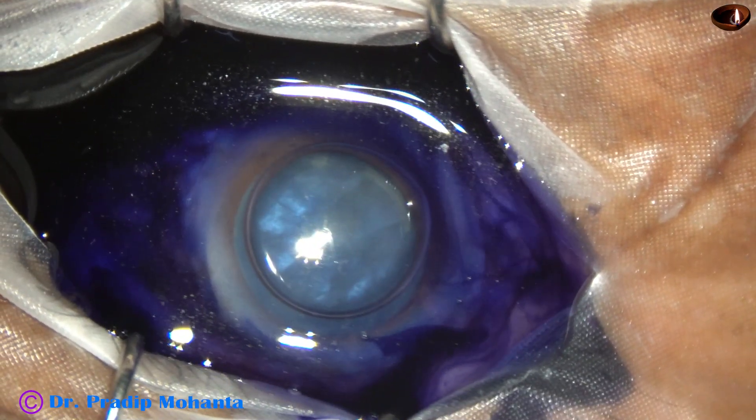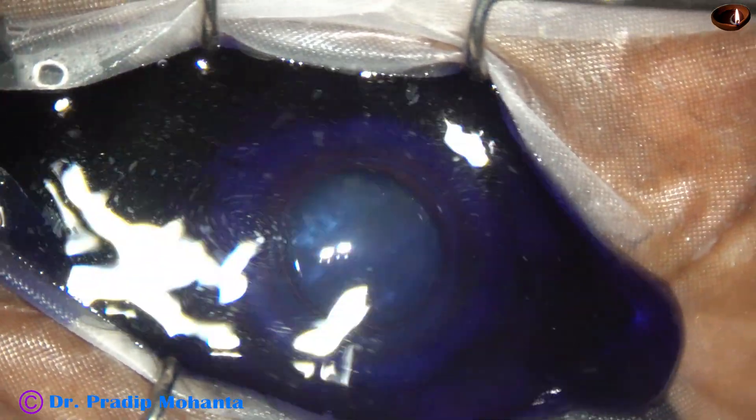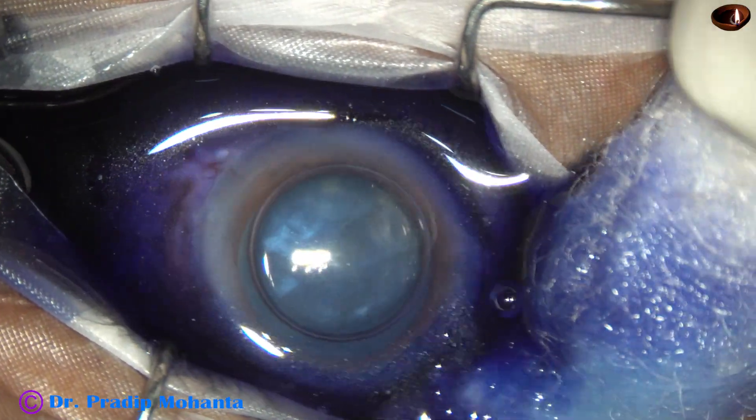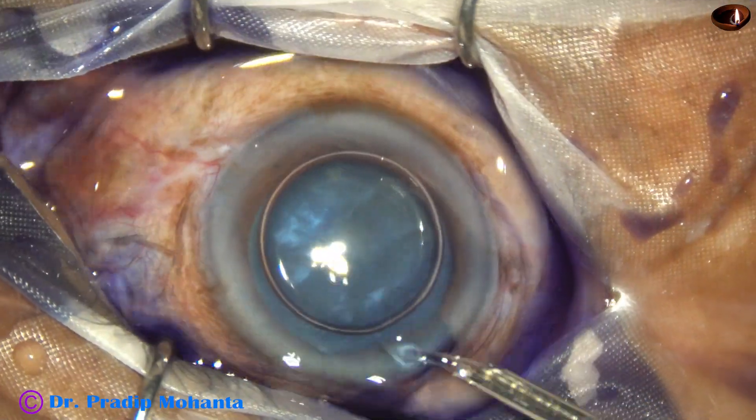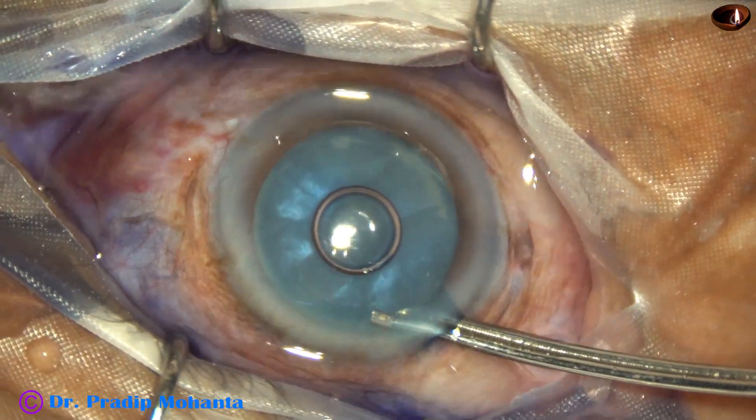This is adrenaline to maintain the dilatation of the pupil. And now the dye is washed out. I use a Simcoe cannula to wash the dye out of the anterior chamber.